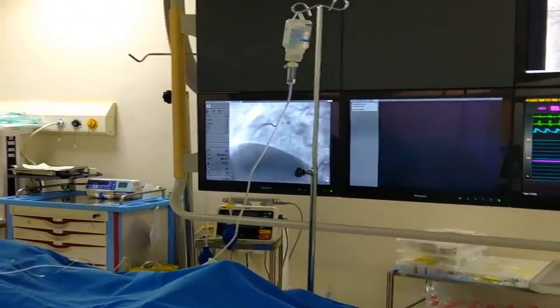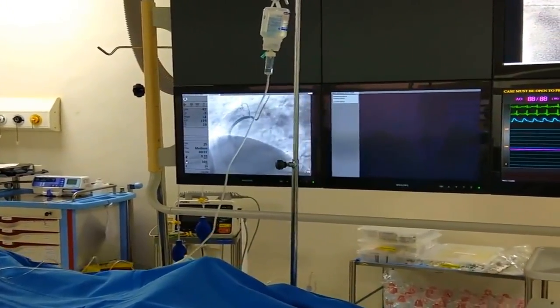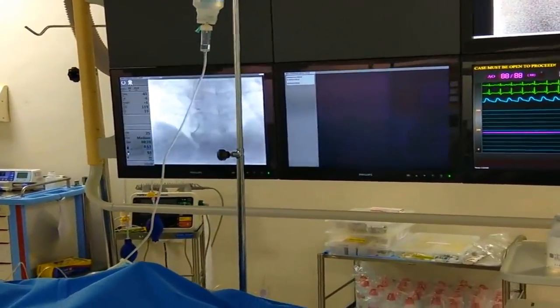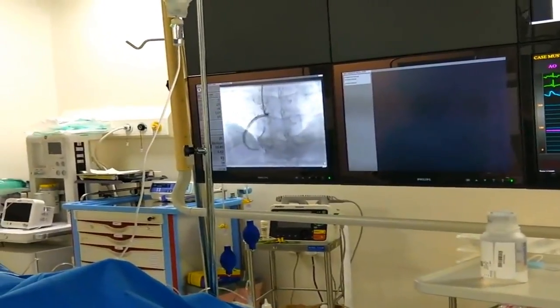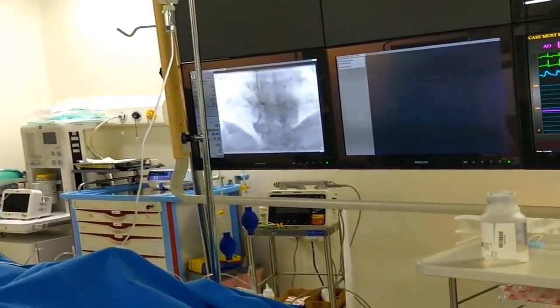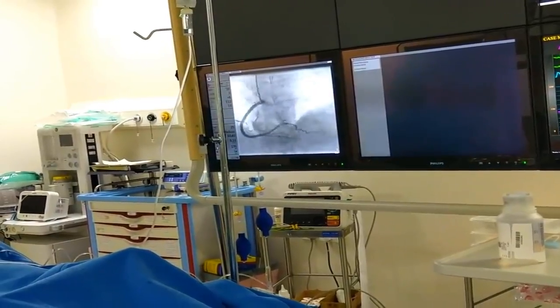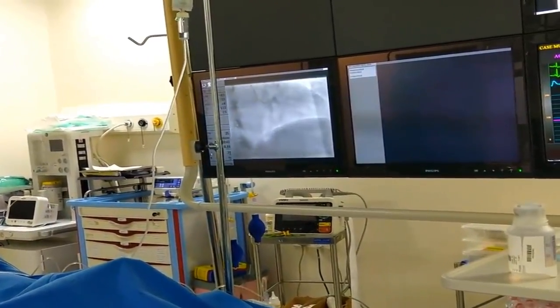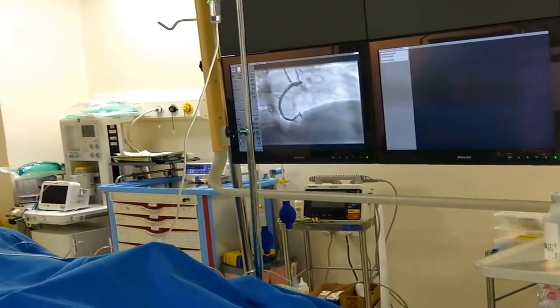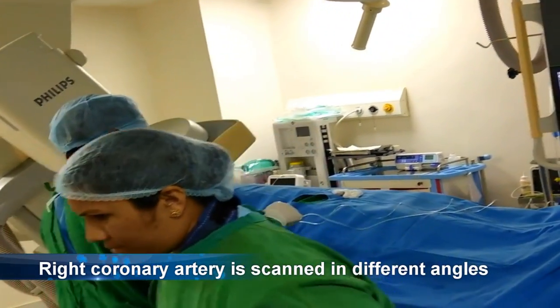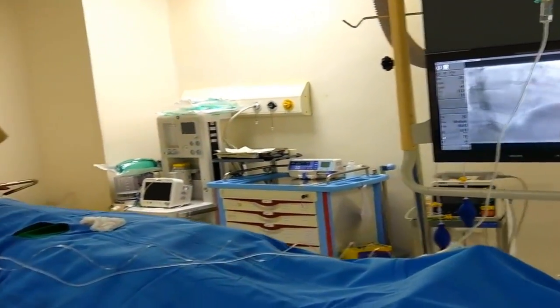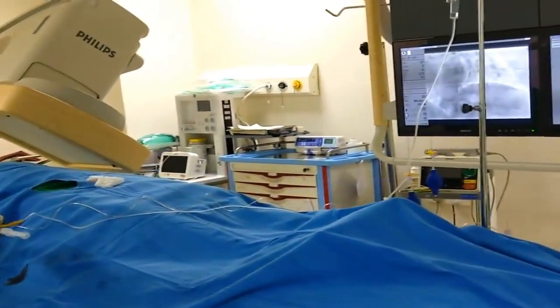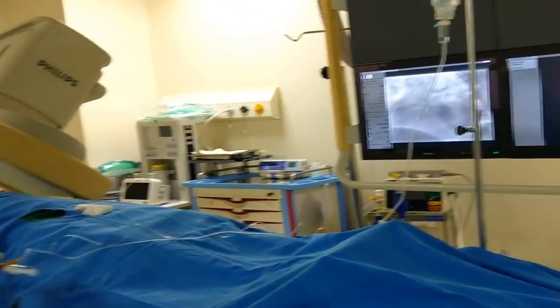Now we are seeing the right coronary artery angiographically — clearly visible. We see the right coronary in different views. In the monitor we can see heart rate, blood pressure, and saturation of the patient. Sometimes the patient may develop a little discomfort or a slight drop of blood pressure during the procedure, so all these should be monitored properly to ensure patient safety and comfort.